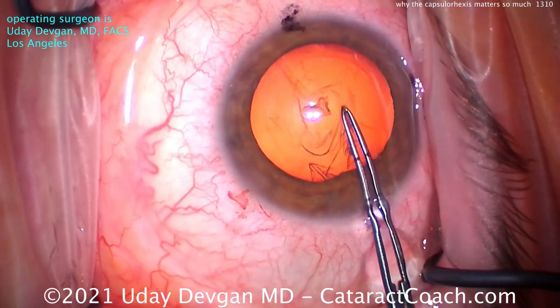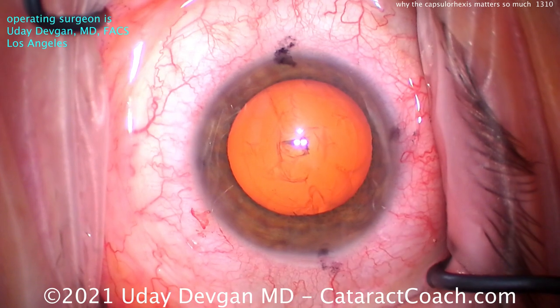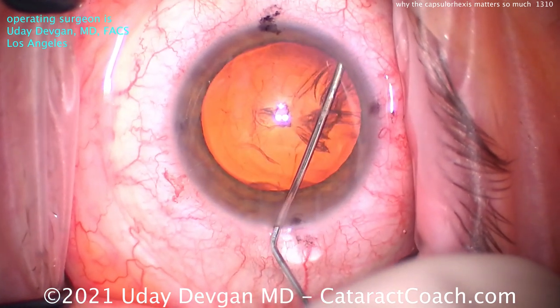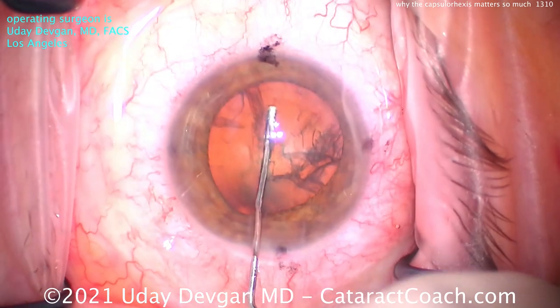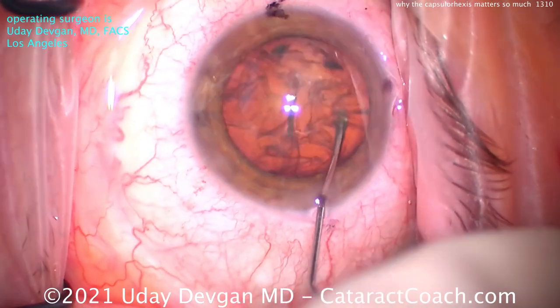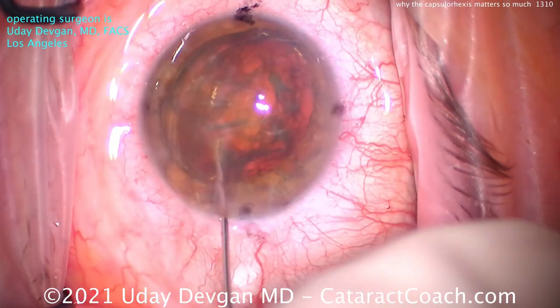The capsule is a little bit elastic. It's why you see some of these cases where we prolapse the nucleus, parse it out of the capsular bag, and that rhexis just stretches. Now you may not have that same ability if you have a weak or ragged edge, or a part where it ran out — then you may run into issues of capsular weakness and that rhexis edge could run out. But if it's continuous like this, there's a strength in that.